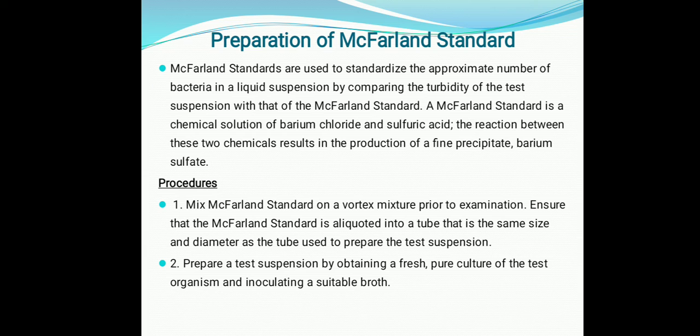Then, in the presence of good lighting, visually compare the turbidity of the test suspension with that of the McFarland standard by comparing the clarity of the lines on the Wickerham card.